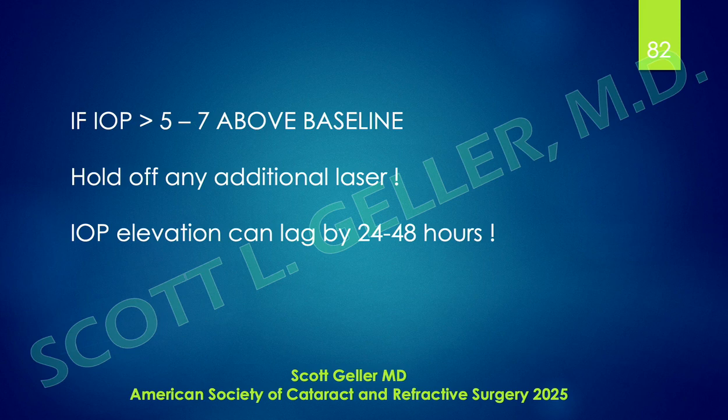Most patients with elevation of pressure will spontaneously go down to baseline, but it might take several weeks or several months. If the elevation is not pathological, you can just have them come in and observe. Let's just check it again. I can't do more laser. It's not good. I would advise anybody not to mask the potential for elevated pressure with medication.